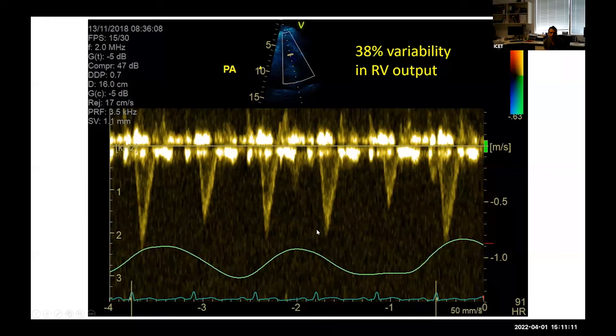So that kind of narrows your options down to tamponade or constriction. But if it is actually more than 40%, it is just sitting there at 38%. Numbers are guides. So it can be, but you've got more than normal, and you've got a pericardial effusion.